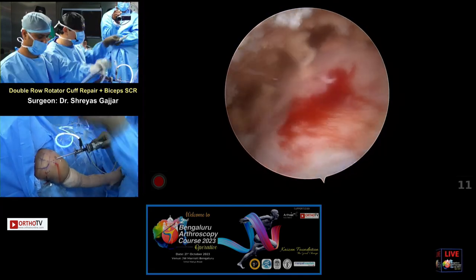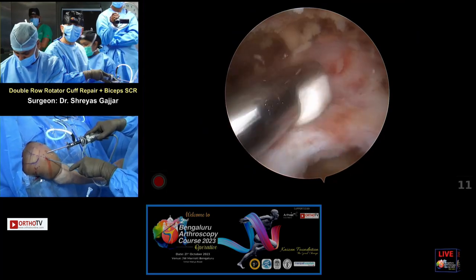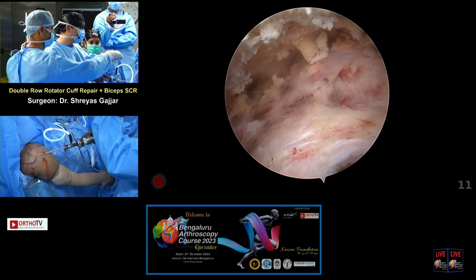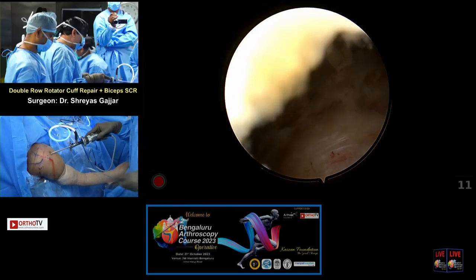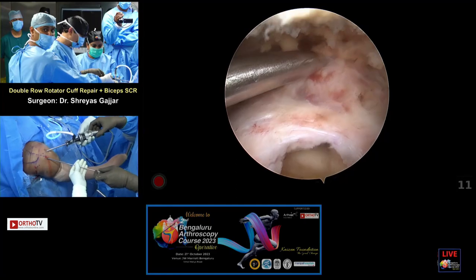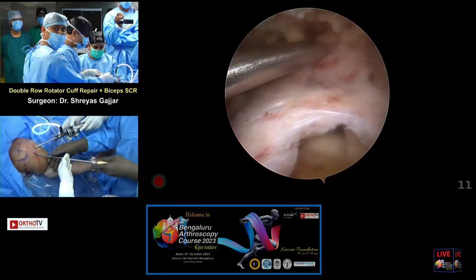I wish I can just stop that little ooze on and off. So we have a clear picture. Okay, can we have a triple dam, please? So Wissinger rod first. And the triple dam, please. Hold the pouch, please, sister. Thank you. Just hold the pouch. Don't let go.